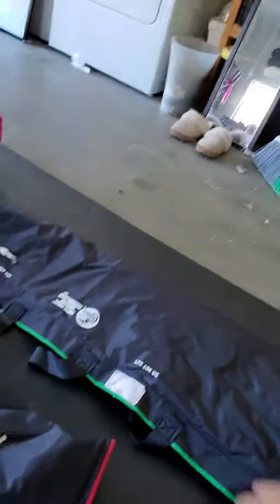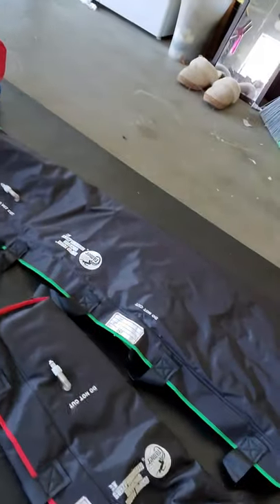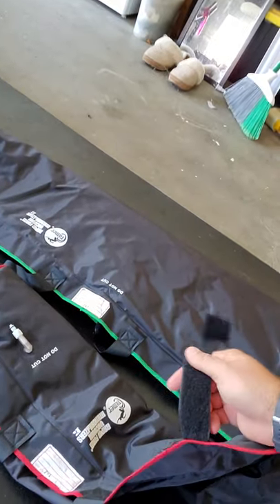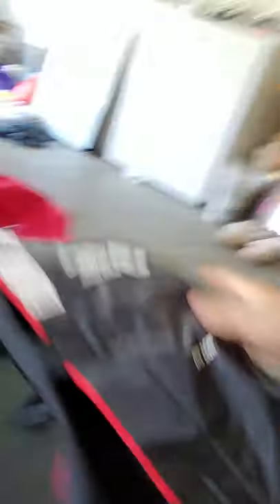So these are vacuum splints. This is the Kramer version, which just has a velcro strap. They are not solid — they're filled with these little micro beads. They come in different sizes.